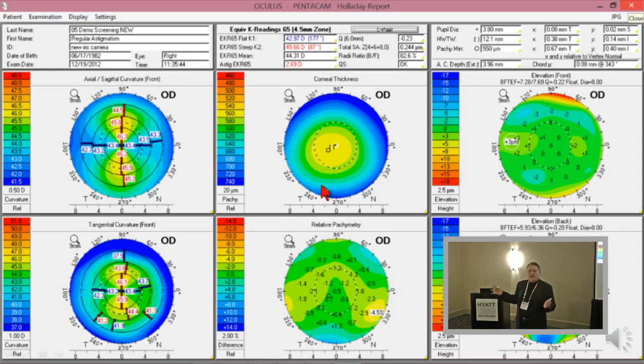And so what Koch found out is you can make that a gradual increase in spherical aberration if you take the Z40, the Z60, and the Z80, and you add them all together, you do get the parabola, okay? So what his paper shows is the sum of those three terms is the value to use to neutralize what the companies report, because they also report the spherical aberration in Zernike terms, but it's not the 40, it's the sum of those three.